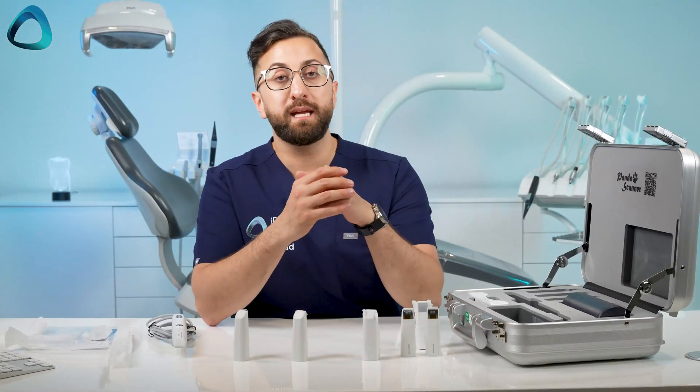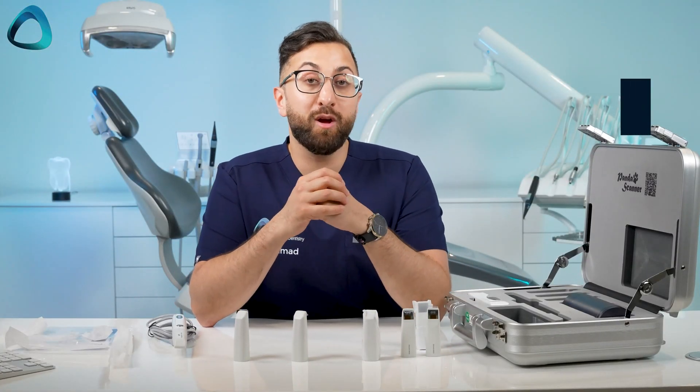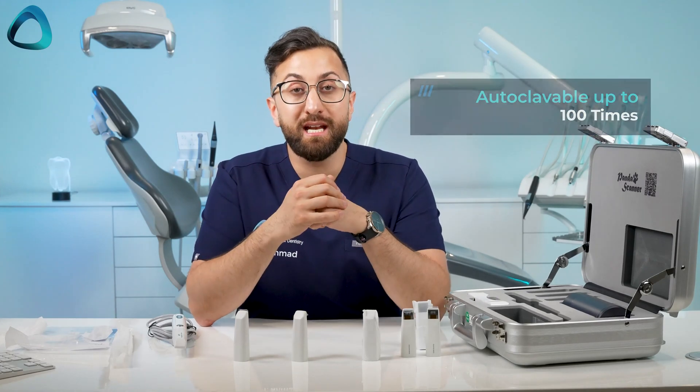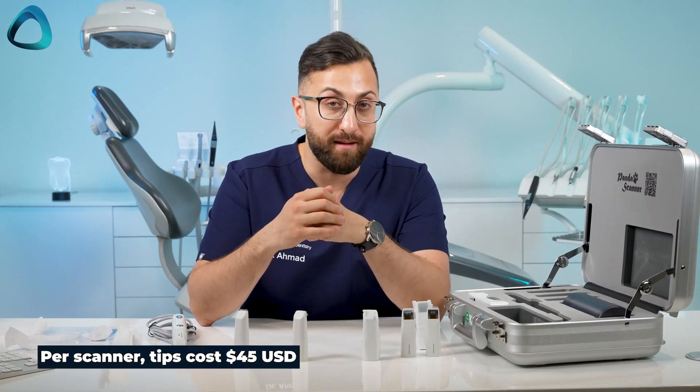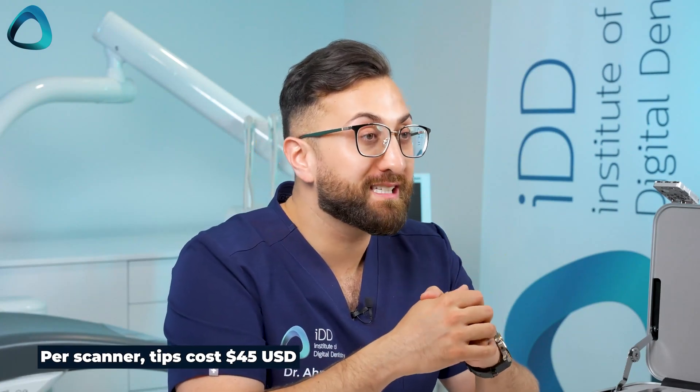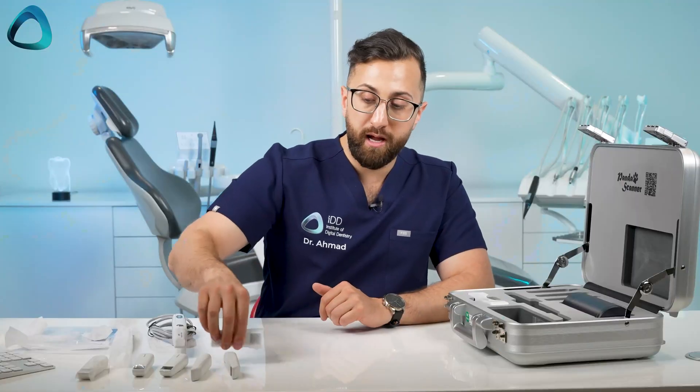The company tells me that these scanner tips can be autoclaved up to 100 times and each scanner tip costs $45 USD. What this means basically is it's around 45 cents per patient to scan them, because obviously between every patient you'll be autoclaving these scanner tips.